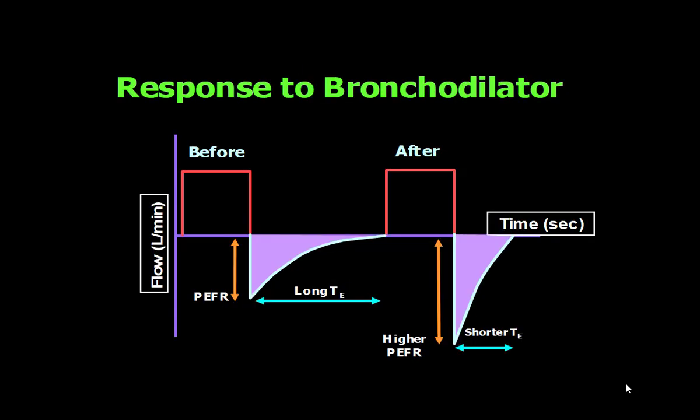The response to bronchodilator therapy can also be understood. The PEFR will increase as soon as bronchodilators work, and the expiratory time will also be reduced if it works properly.